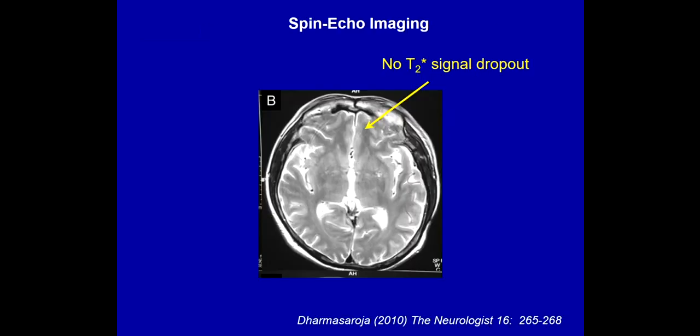Now, aside from fMRI, there are some reasons to do spin echo imaging. Here's a picture, an axial view. So you're pretty near the sinuses. If you were to do what's called a gradient echo image, that's like a pulse acquire, where you do not get T2 star compensation, there's often a hole up here. If you do a T2 star compensated spin echo image, we recover this dropout.